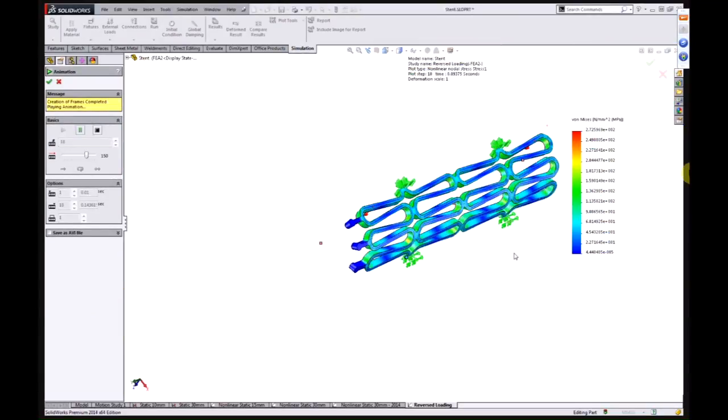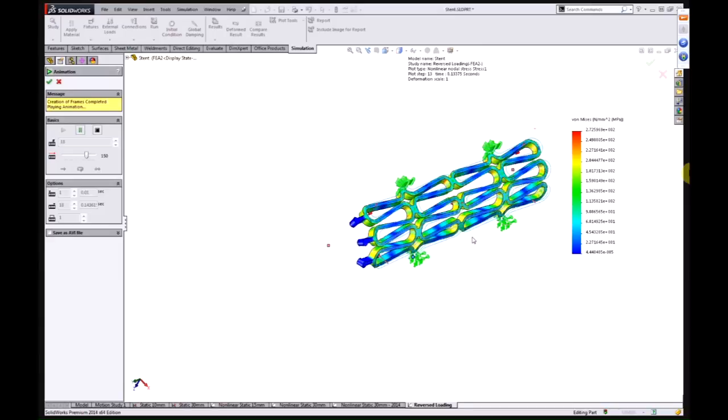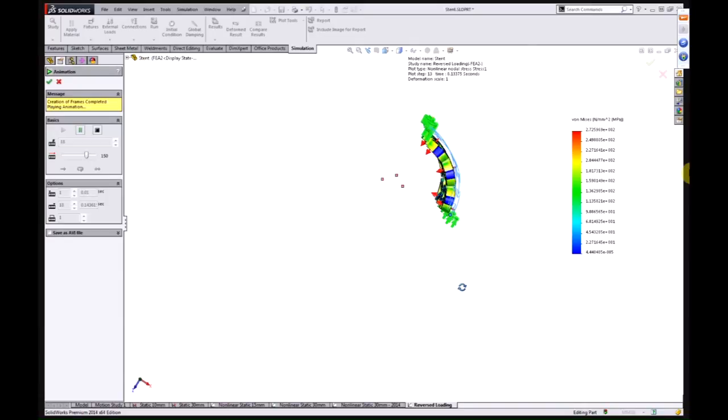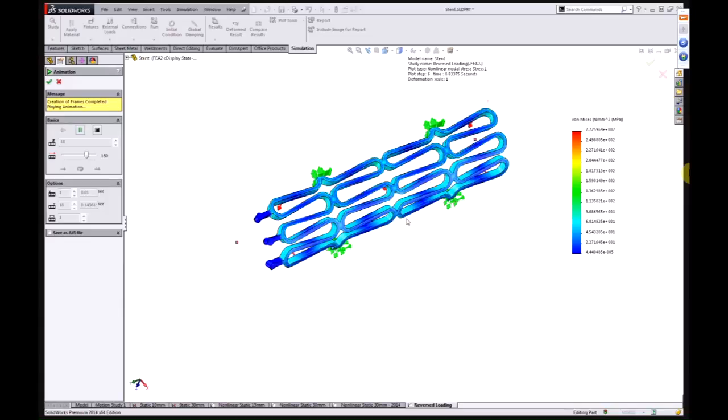Now, this is the part in isolation. If we were to put in a model of an arterial vessel, an artery wall, or even an internal balloon that's sometimes used for inflation, the contact modeling is going to make it difficult to get very far in terms of the distortion. So anytime you want to consider those sorts of conditions, multiple contact interactions, large distortion, all that stuff combined, it's often a more appropriate choice to look at a tool like SIMULIA Abaqus.